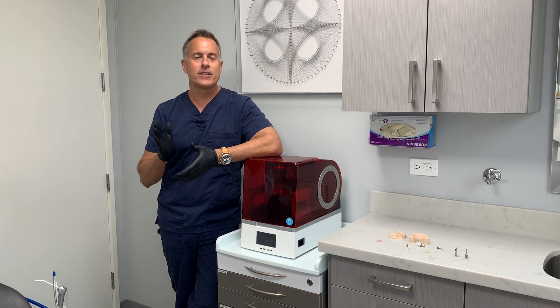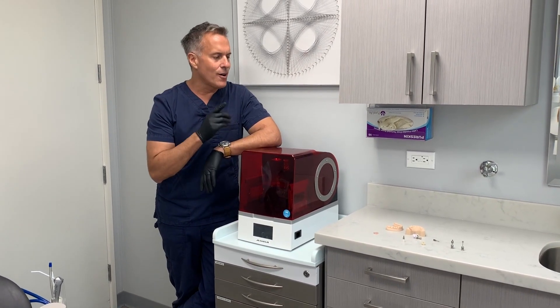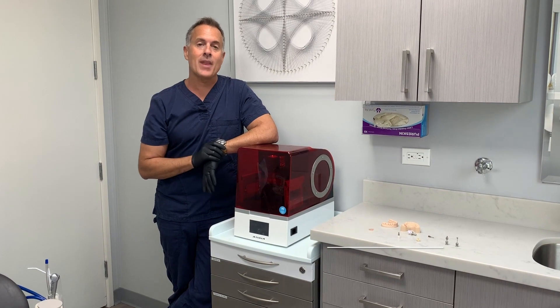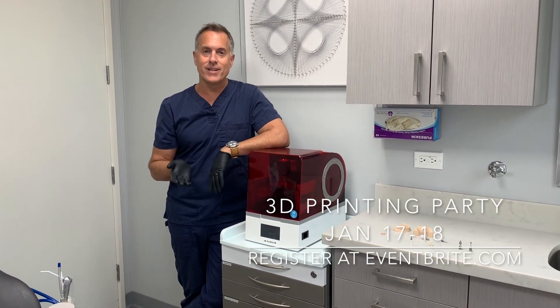So today I want to talk a little bit about this printer here, the Asiga Max UV, and all the parts and pieces involved in implant analog models. Now if you want to learn more, I've got two courses coming up in 2020 — my 3D printing party.